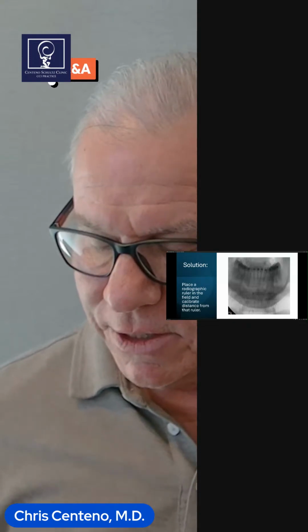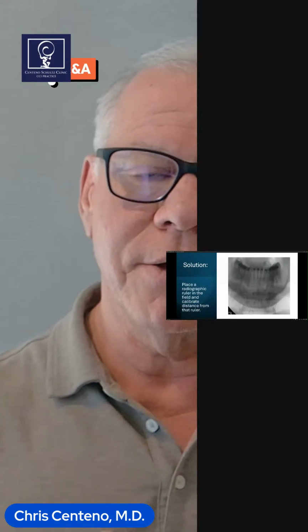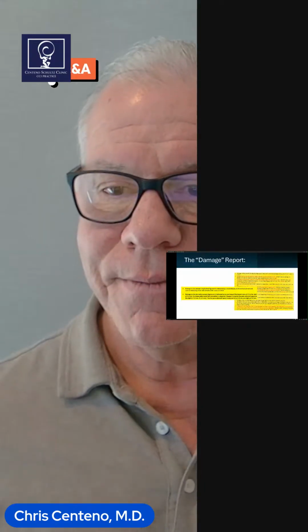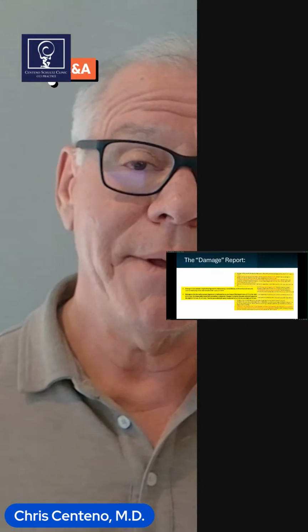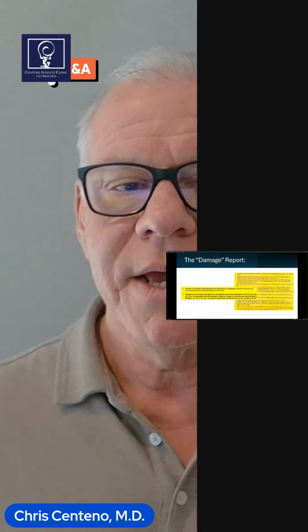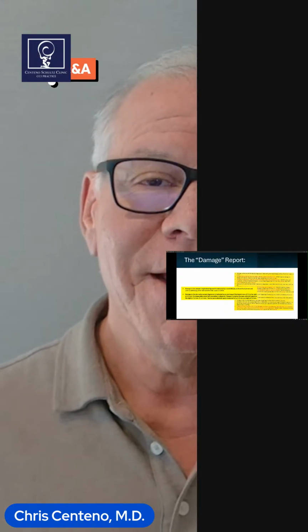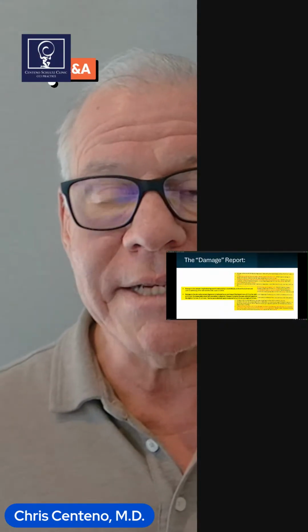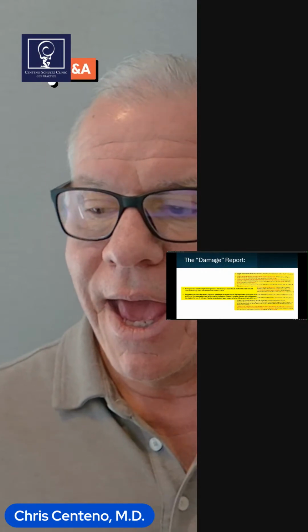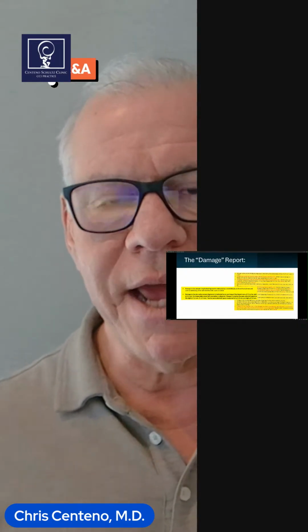So that's the way we're going to do this calibration so that we don't have issues with a machine that's too far away or too close, or a patient that's too far away or too close, causing measurement errors. Now, I've been a big critic, you probably heard me say this lots of times, of DMX reports, right? My least favorite DMX report on earth is what I call the damage report. This report drives me crazy as a physician. You get this yellow highlighted gunk, and you see these measurements, and it's saying damage, damage, damage, damage, damage.